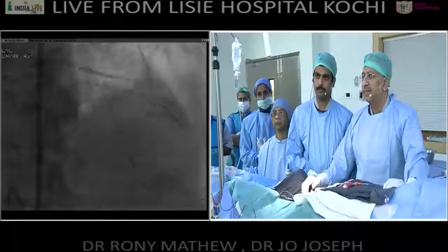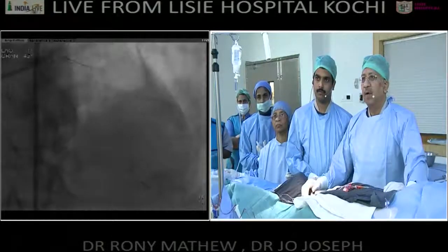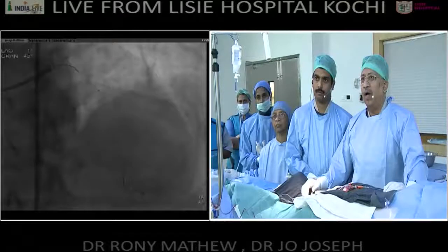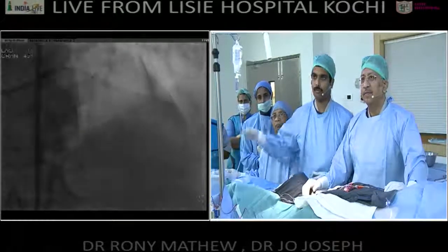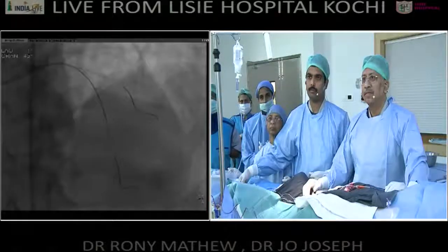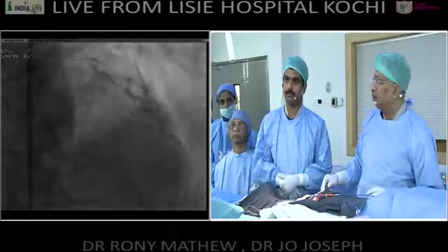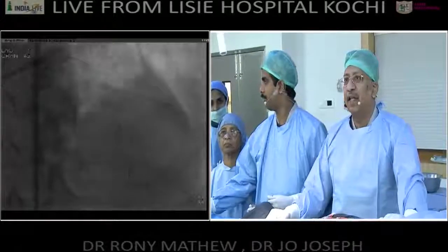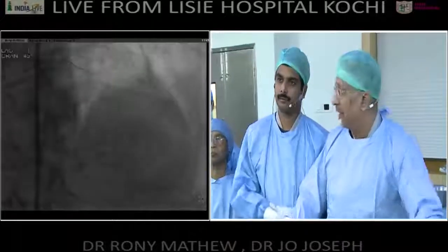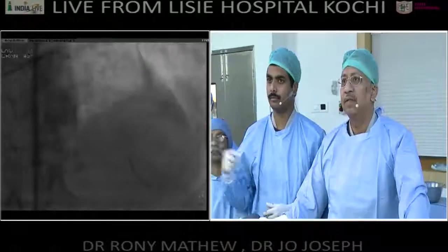Next. Now I crush that. You didn't show me the crush, but now this is the, one second, you're moving too fast. Anyway, after the crush, I did another OCT run. You're not with me. Show me the OCT run.